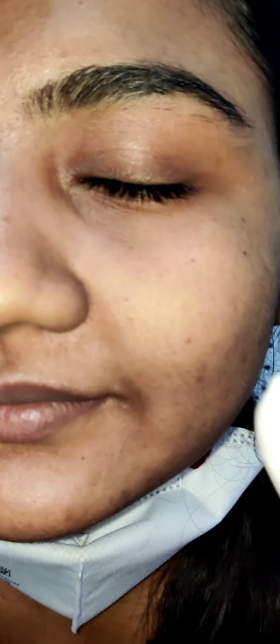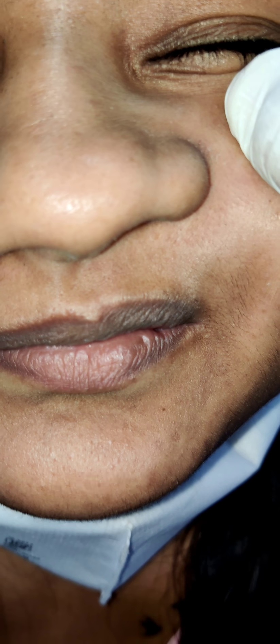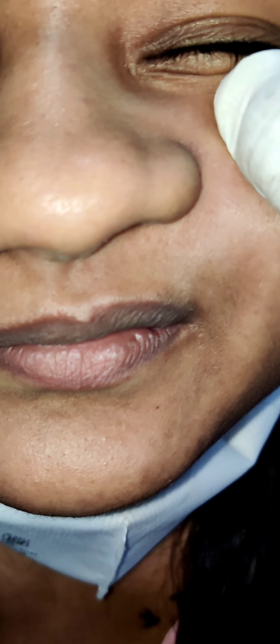Then there is the Cottle test that we perform for the nasal valve. For that, we will have to retract the cheek of the nose superiorly and laterally like this, and ask the patient whether there is some improvement in their nasal breathing or not.